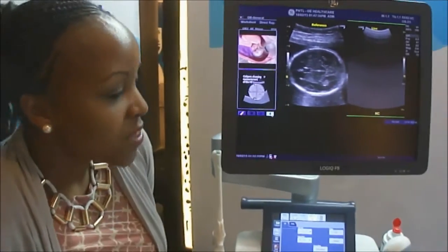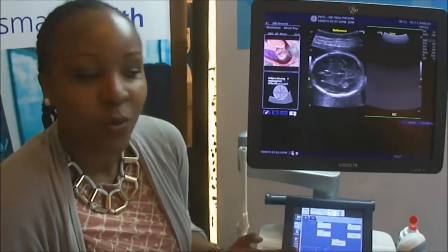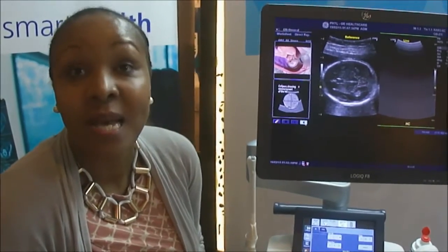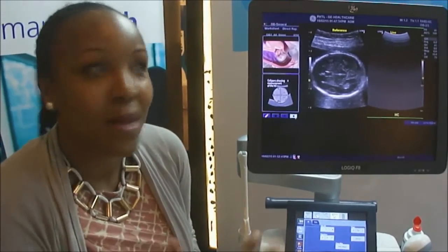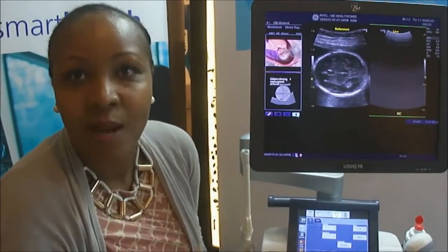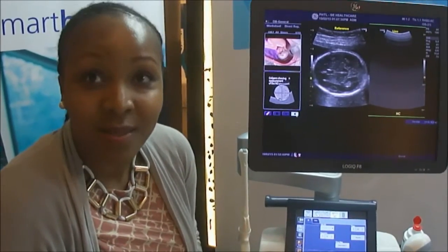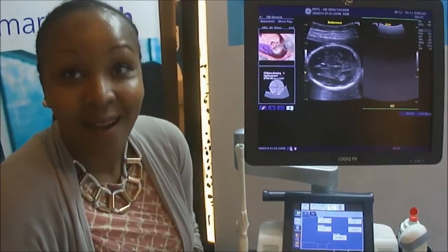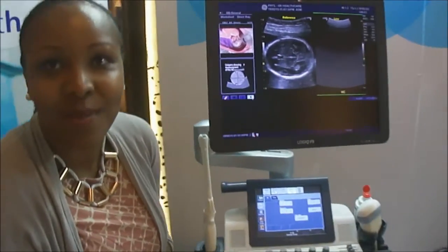One more thing that is very unique to GE is raw data. What raw data does is enable the doctor — once the patient leaves — to manipulate the image, add for example grayness, contrast, and also do measurements. So it's as if the patient was still there, even though they're gone, and you can continue to do measurements.